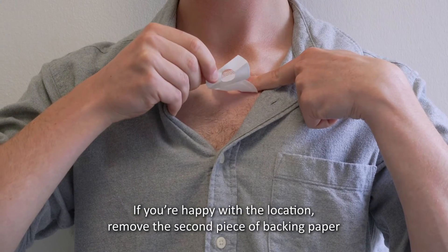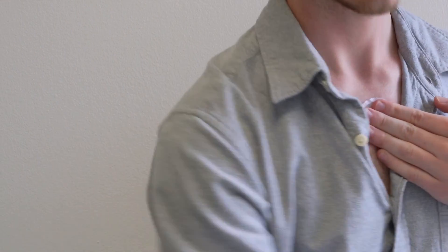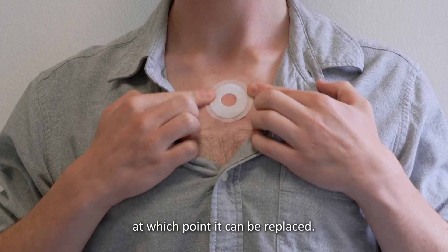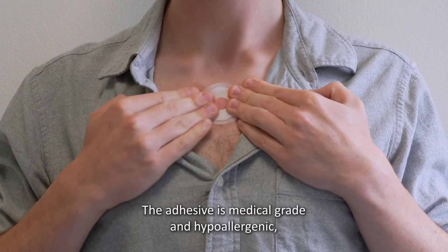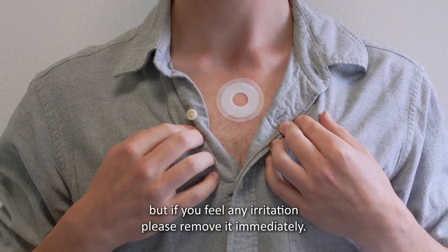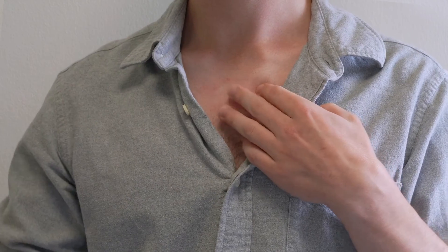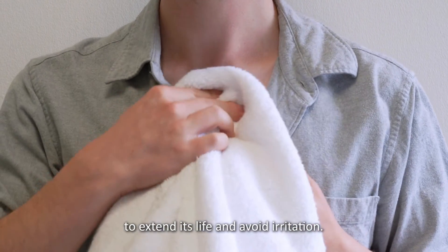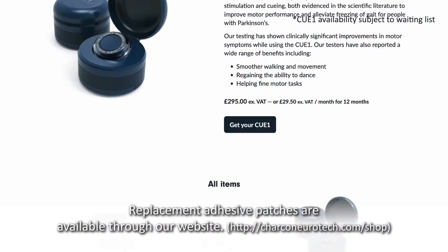If you're happy with the location, remove the second piece of backing paper and firmly press the adhesive down to make sure it's secure. It is waterproof and sweatproof and will last for roughly 14 days, at which point it can be replaced. The adhesive is medical grade and hypoallergenic, but if you feel any irritation, please remove it immediately. Please pat the adhesive dry after bathing to extend its life and avoid irritation. Replacement adhesive patches are available through our website.